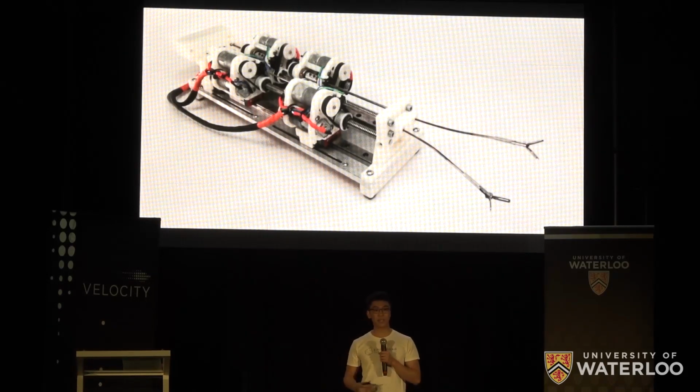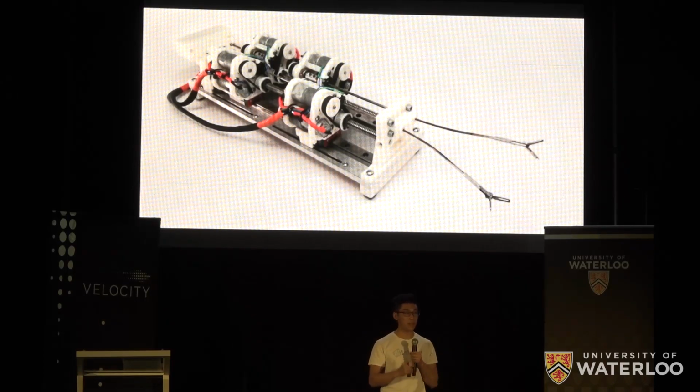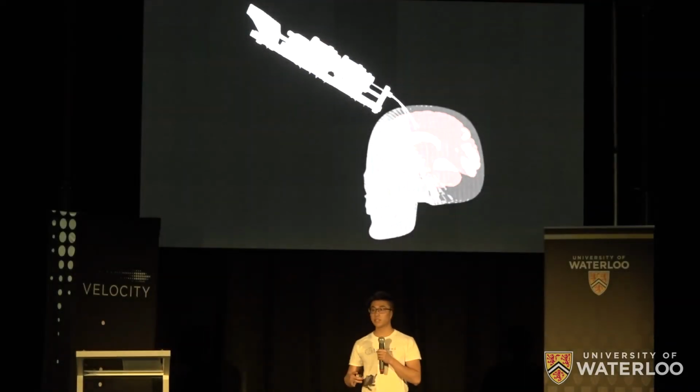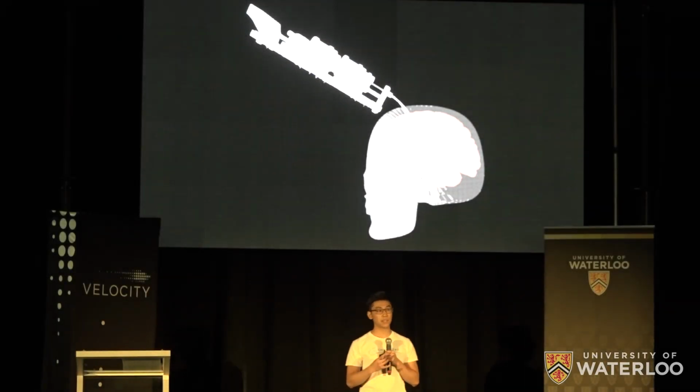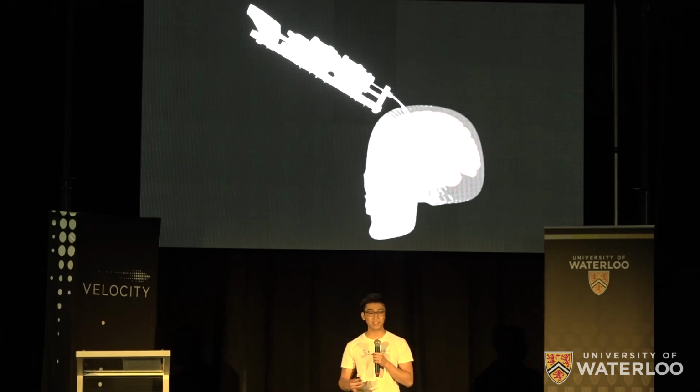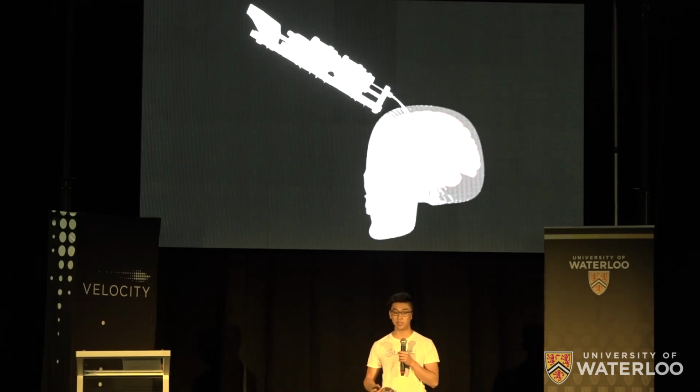Currently, we have a prototype that is capable of bending around the brain, which allows the surgeon to navigate the skull without disrupting neighboring tissues. Since the surgeon is currently restricted to a single camera view, their visibility is low. To solve this, we made a 3D visualization program that enhances the visibility of the entire operation.